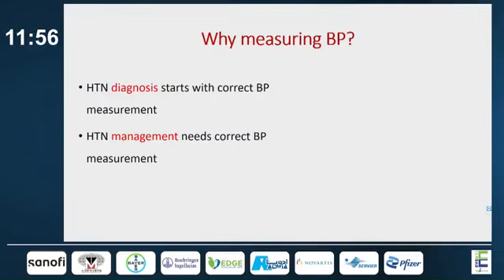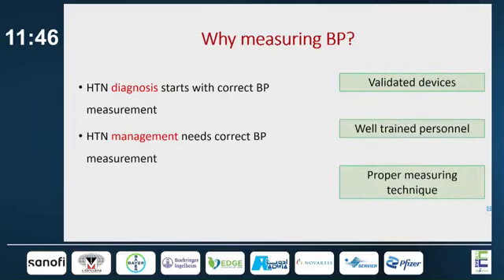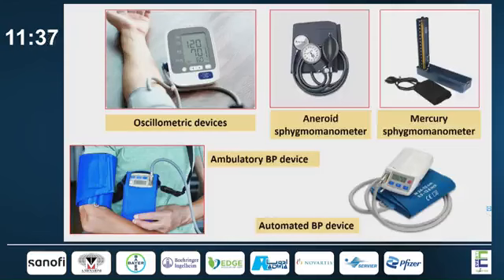Why do we need to measure blood pressure? We need to measure blood pressure because diagnosis, management and follow-up of patients with hypertension need a proper and correct blood pressure measurement. For this, we need validated devices, well-trained personnel, and proper measuring technique. In this lecture, we'll focus on the device.